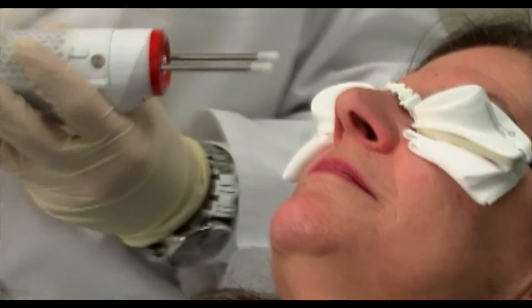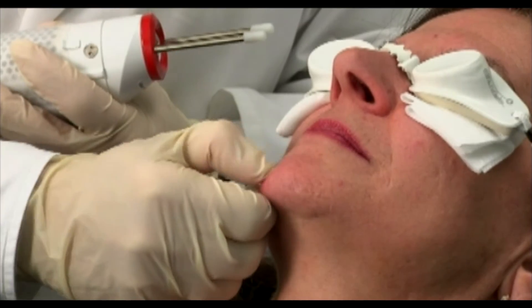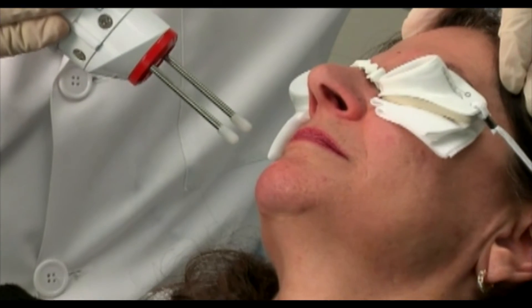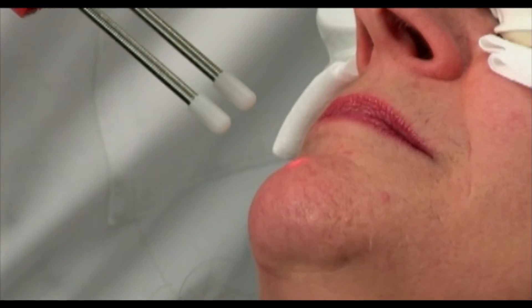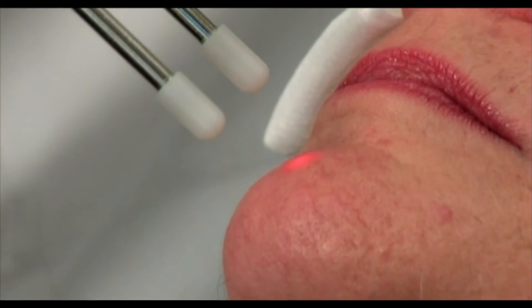If I take my finger and try to press this vessel, I can no longer blanch the blood out of it because there's been a thrombosis in the vessel. The vessel has been coagulated, and that's the injury we need to induce to make that vessel go away. As I said before, over the next month this will slowly resolve.